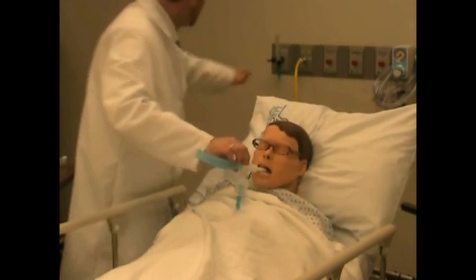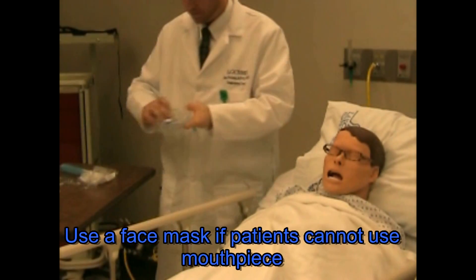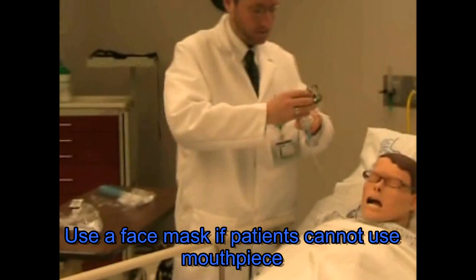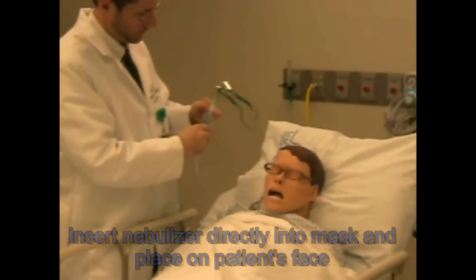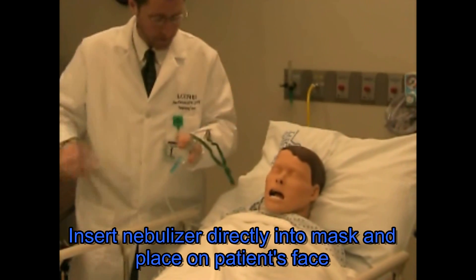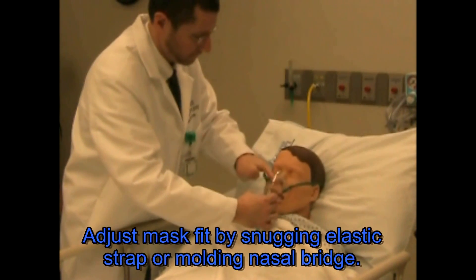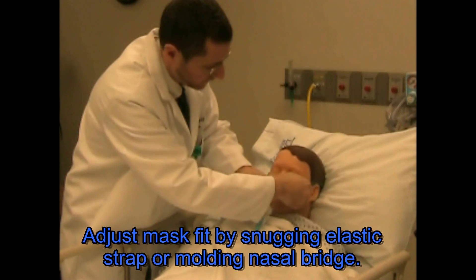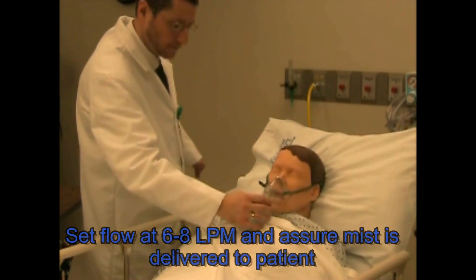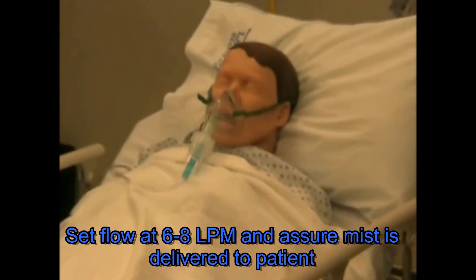Now that's a little bit tough for you, but we have another way that we can do this. Patients that are unable to manage the mouthpiece adapter can use a mask and place the mask on the patient's face for direct aerosol delivery to the mouth and nose. I'm just going to take your glasses while we put this mask on and leave them here on the bedside table. We're going to put a soft mask on — this will fit relatively loose and you'll get your medicine through that. How's that fit? Good. The nebulizer is turned up to six to eight liters and a mist is being delivered to the patient.